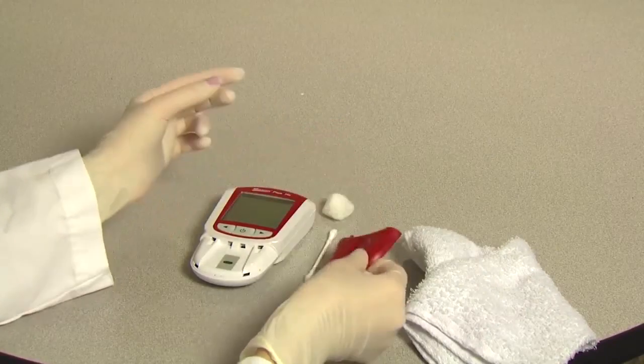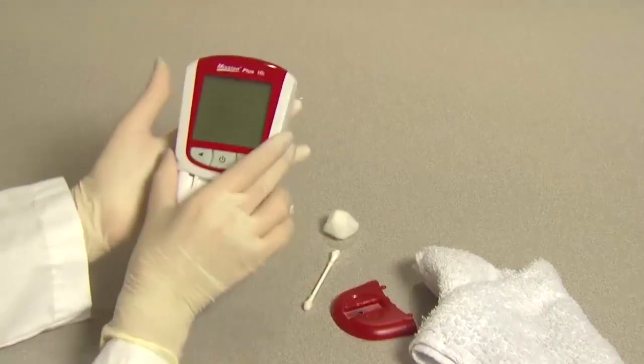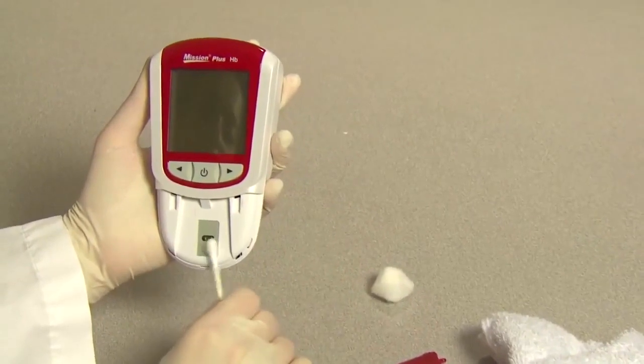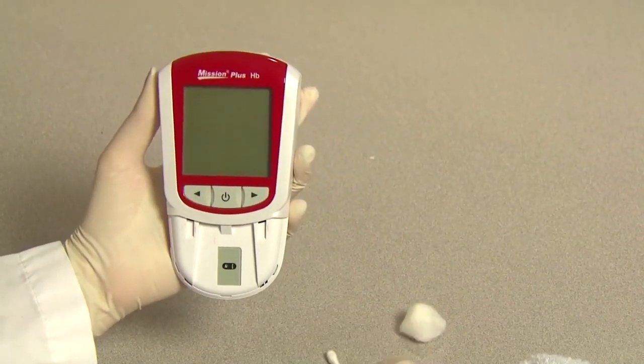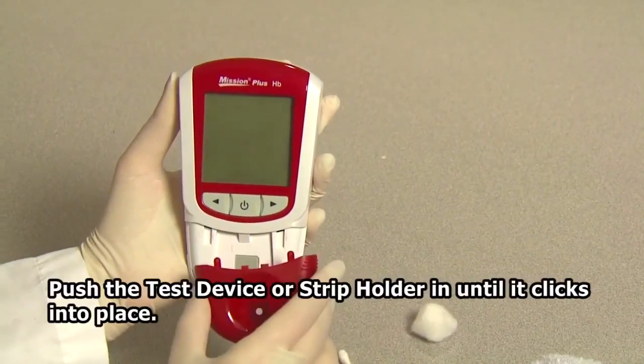Wipe down the meter sensor area with a cotton swab. Make sure you do not scratch the transparent window covering the sensors. Slide the test device or strip holder back into the meter.